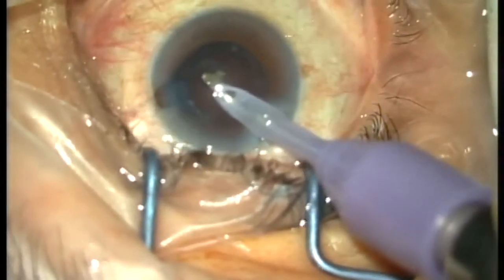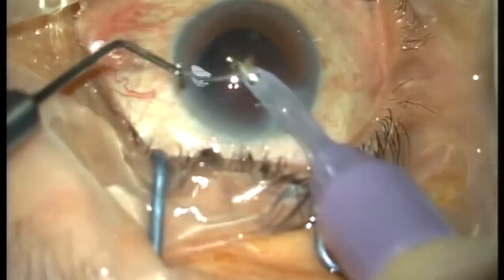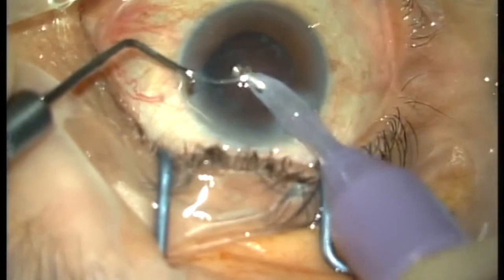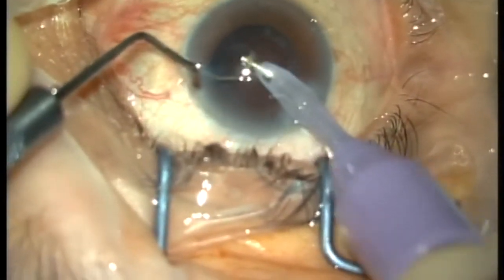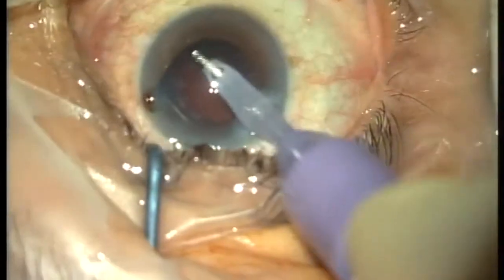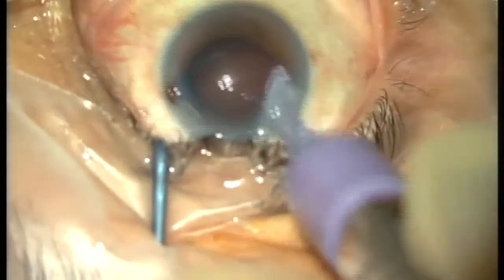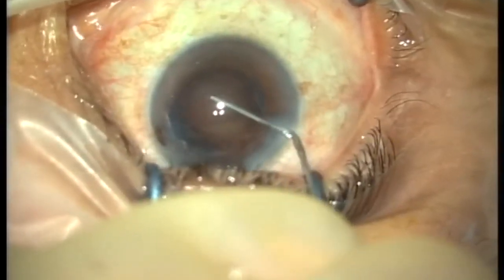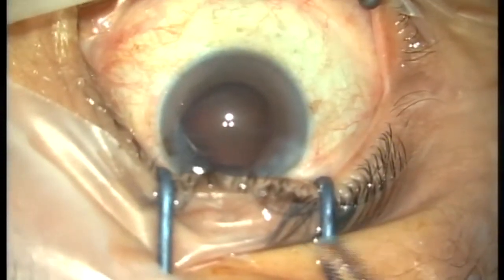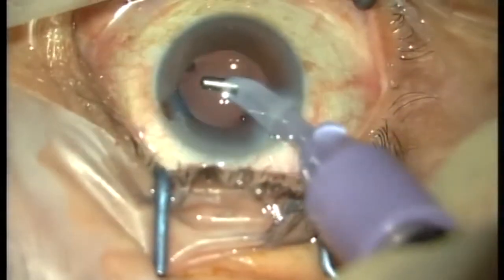Finally, the removal of cortex was performed. Note in such a case, very minimal cortical matter is seen after removing the nucleus. This is followed by the implantation of the artificial lens and finally complete removal of the viscoelastic. Intracameral antibiotic is a must, and hydration of the wound was made to ensure the wound is watertight at the end of the procedure. Thank you.